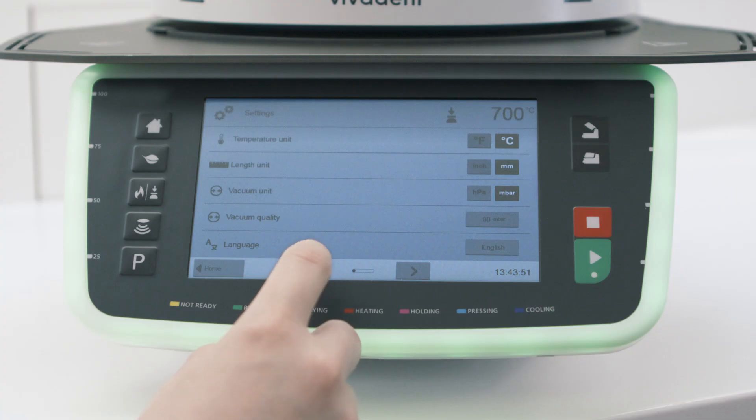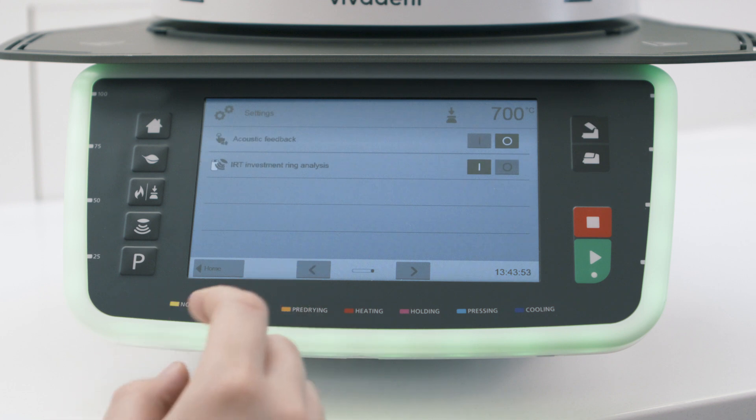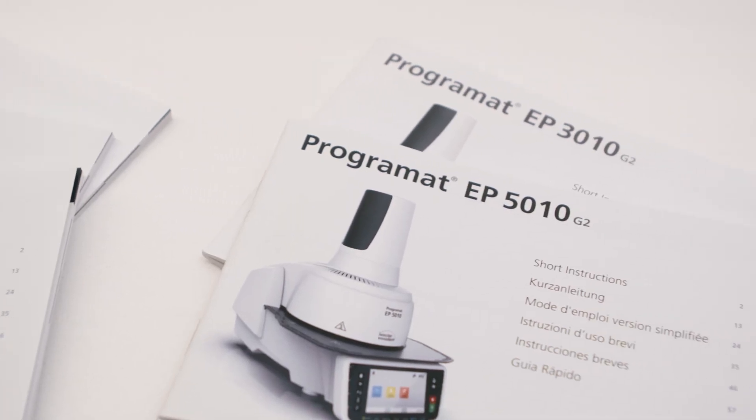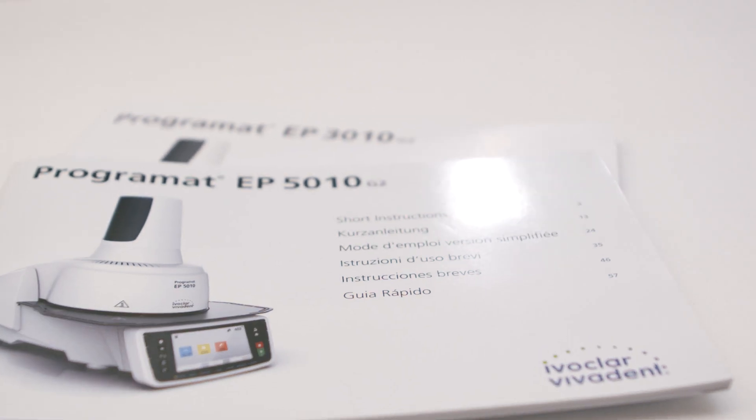If you use an alternative investment ring system, deactivate the IRT investment ring recognition. Please see the operating instructions for further information.